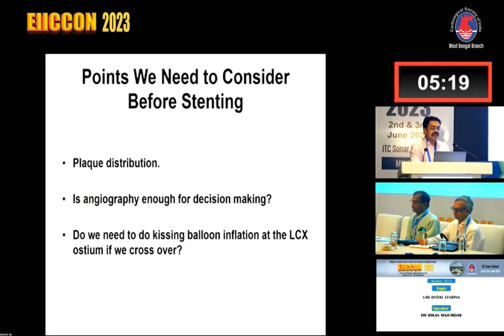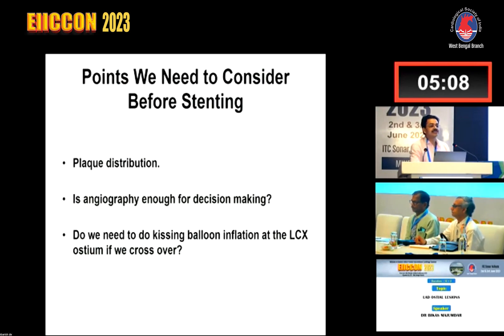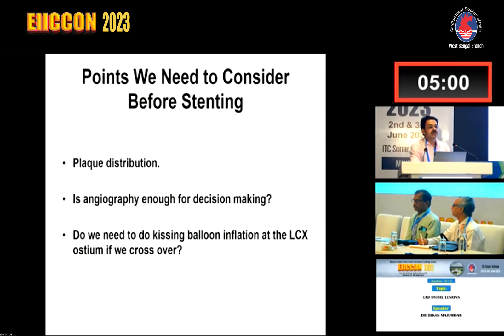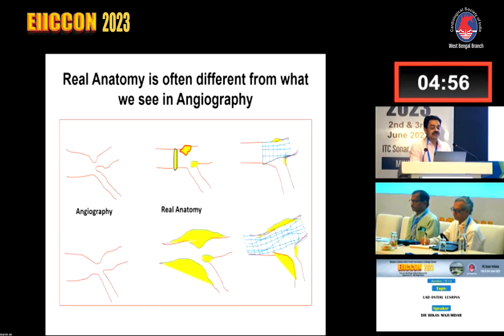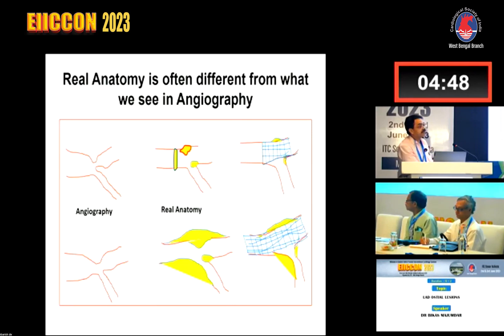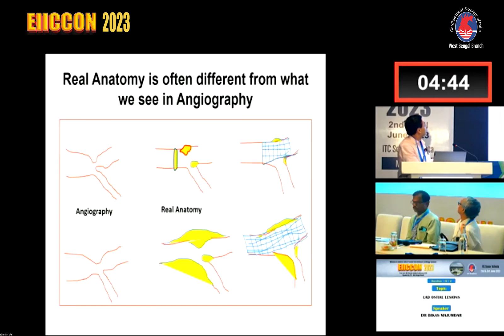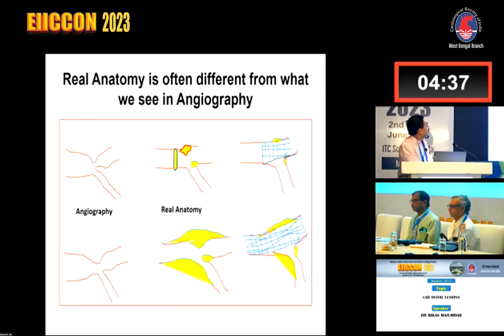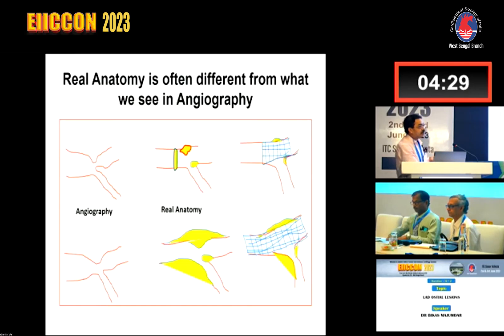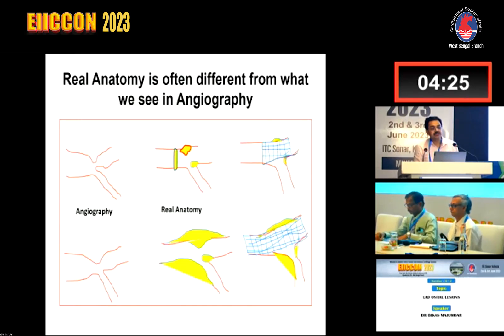Is angiography enough for decision making in this kind of lesion? This is a pictorial representation of what we see on angiography versus the real anatomy. On angiography it looks straightforward, but there may be plaque extending into the left main which we cannot see. We often underestimate the plaque burden and distribution if we are not doing IVUS in these patients. It is often extremely difficult to stent precisely at the ostium unless there is a very big left main compared to the LAD diameter and very little plaque in the distal left main.